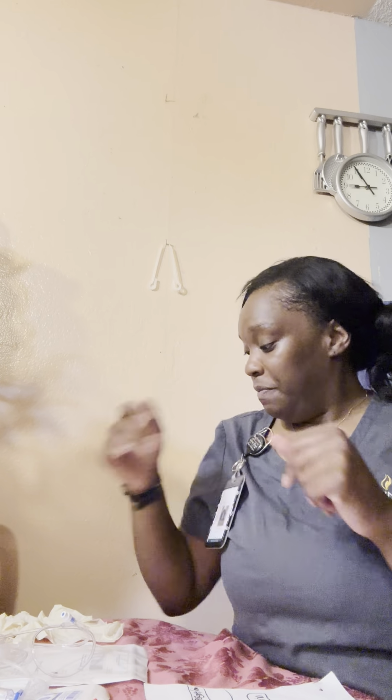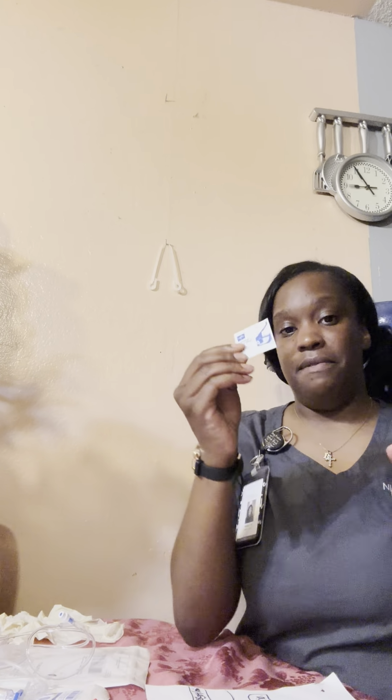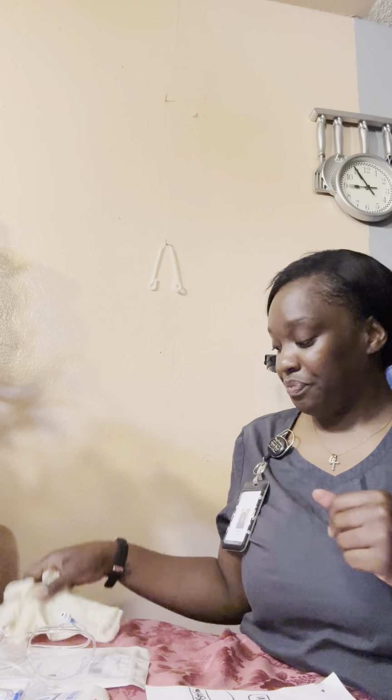I will then explain what I'm going to be doing today, which is administering fluids and medication through their IV peripheral site. I will then ask, do they have any allergies? And then I will also check the charts and ensure they don't have any allergies to any medication. I ask the patient if they have any questions before I proceed. They don't have questions, so I will perform hand hygiene. Forgot to mention that I have an alcohol prep pad. Apply my gloves.